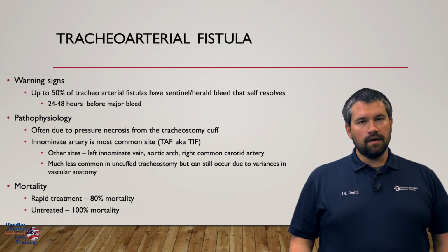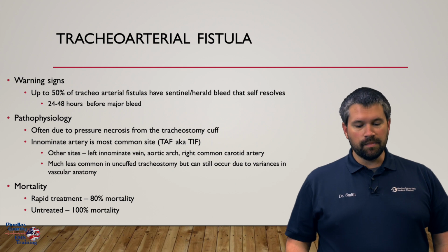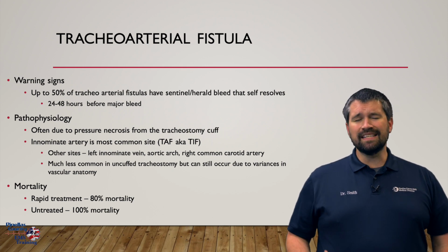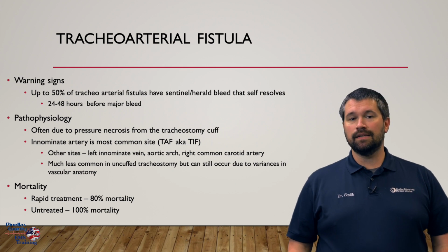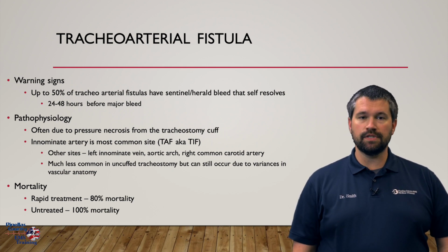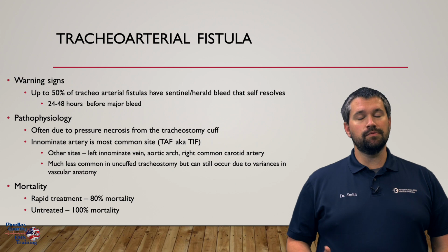It's much less common in uncuffed tracheostomies, but it is still a potential issue. It is a very high mortality. Up to 80% of the people that have this spontaneously will die. Untreated, 100% will die. So if you see this, you must intervene rapidly and transport quickly.